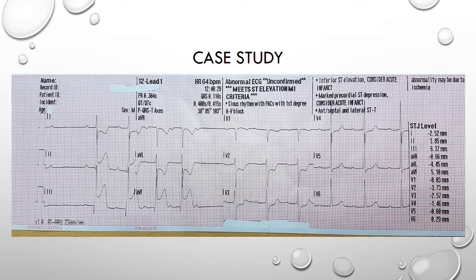In a study on identifying the culprit artery in inferior wall STEMI from the Canadian Journal of Cardiology, it was found that the best criteria to identify the RCA as the culprit was ST elevation in lead 3 greater than in lead 2, and ST depression in lead 1 — and we clearly have that in this ECG. But what else is there?